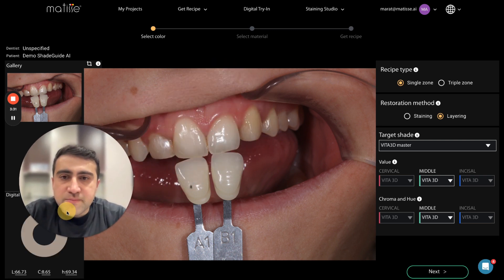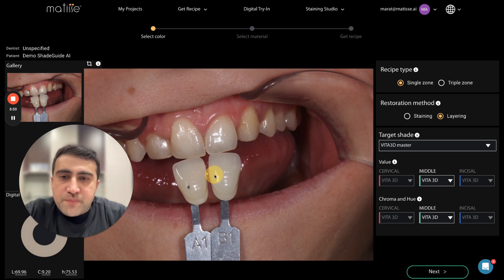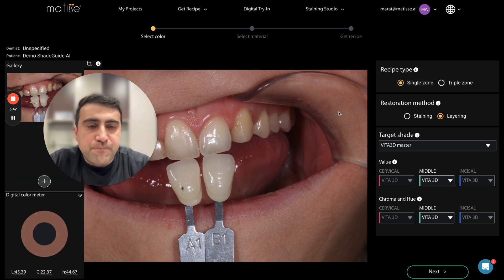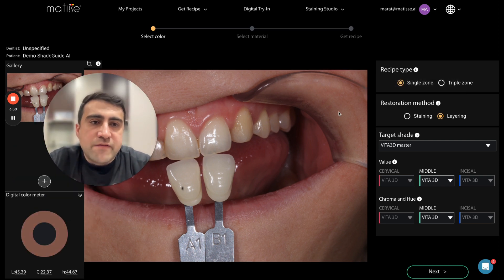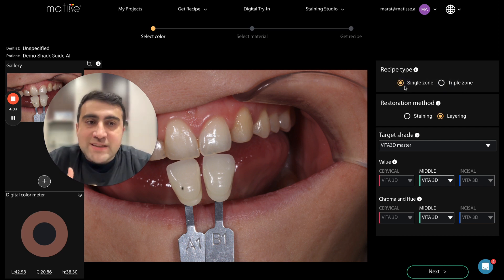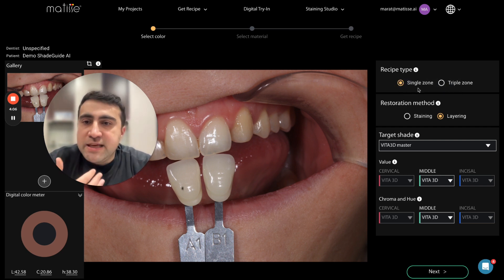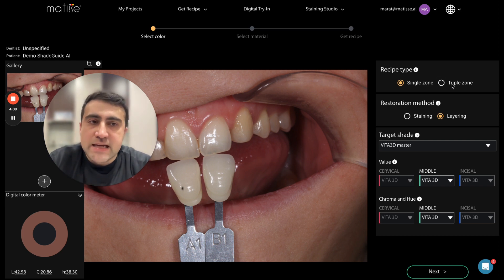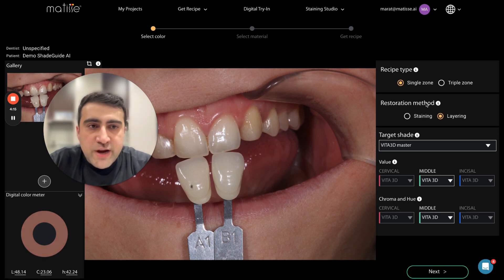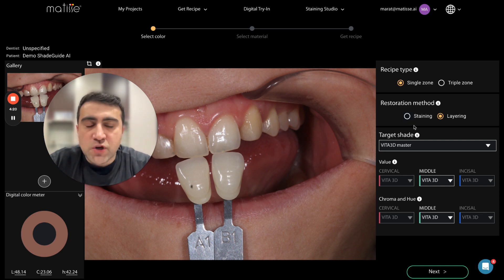We have our case here — the photo we received from the dentist or took ourselves. We start on the right side and give the software all the required information. First is recipe type: do you want a single or triple recipe? Single zone means middle; triple zone means cervical, middle, and incisal. To keep it simple, let's use single zone for now.